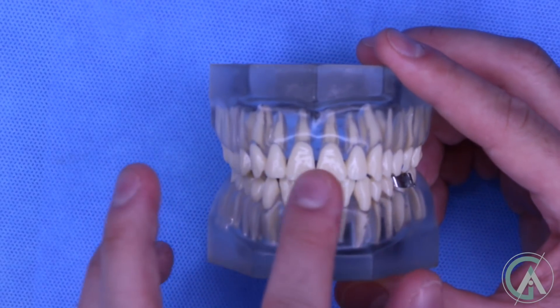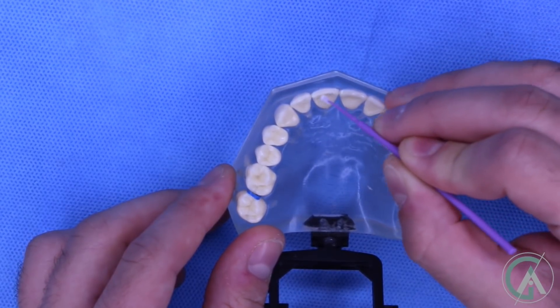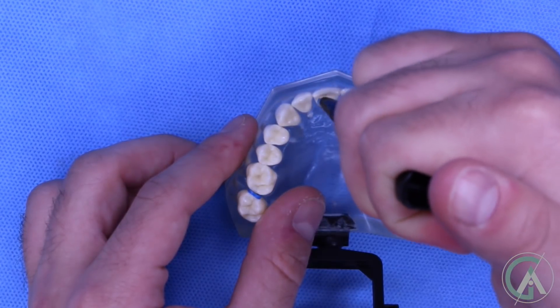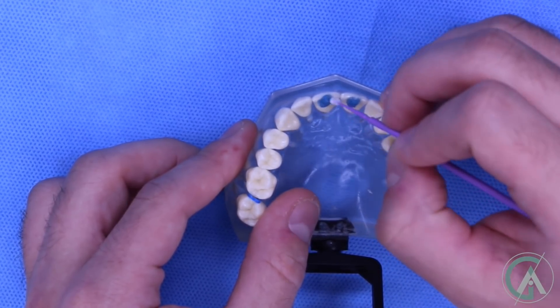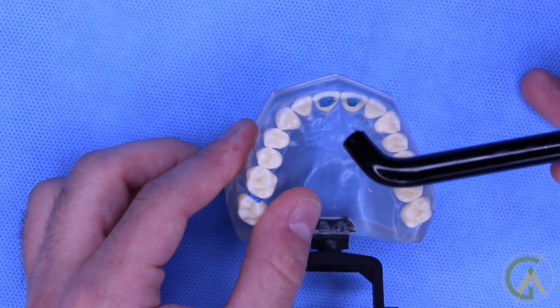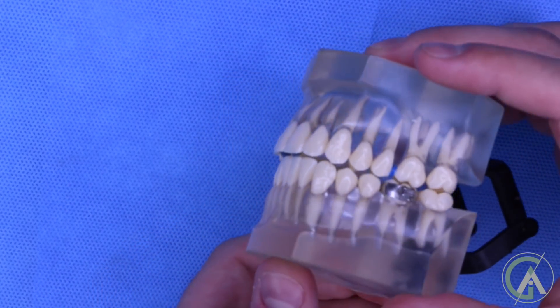And this is how they're placed on your front teeth. Occasionally, your orthodontist might put the Bite Turbos on the tongue side of your front teeth. It's a very similar process — we'll prepare the surface and dispense some of the Bite Turbo material, make sure that it's put on properly, and again cure it with that blue light. For some reason this looks pink on the videos. And again, you'll see a similar thing where your teeth can't come down all the way.